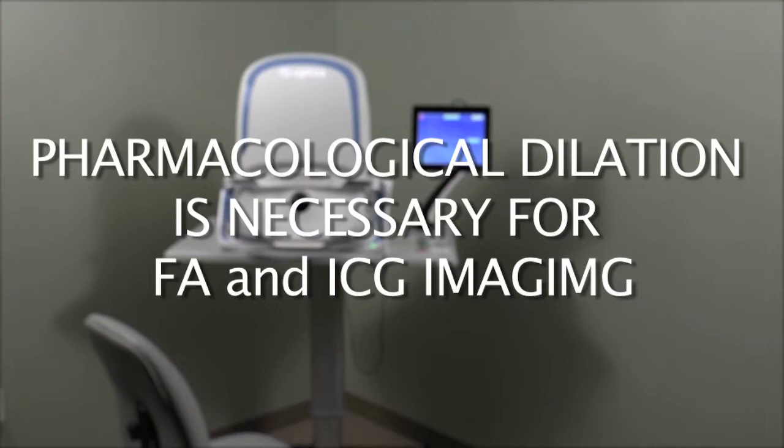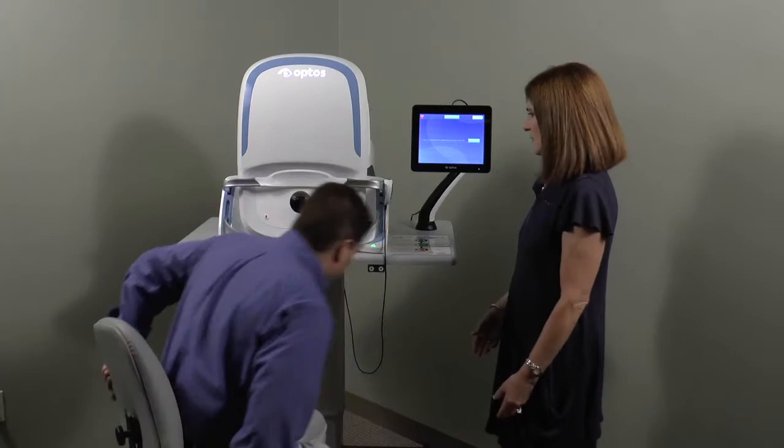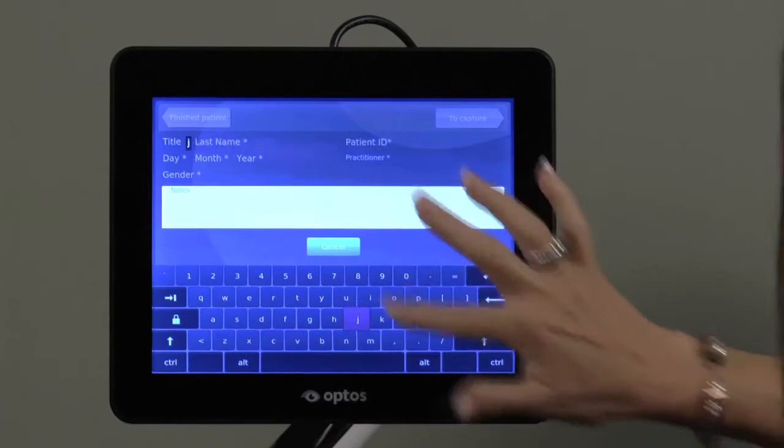You may enter any combination of the patient's last name, date of birth, or ID to access an existing record. If the record does not already exist, you can add a new patient by selecting the Add Patient tab and filling in the first and last name fields.